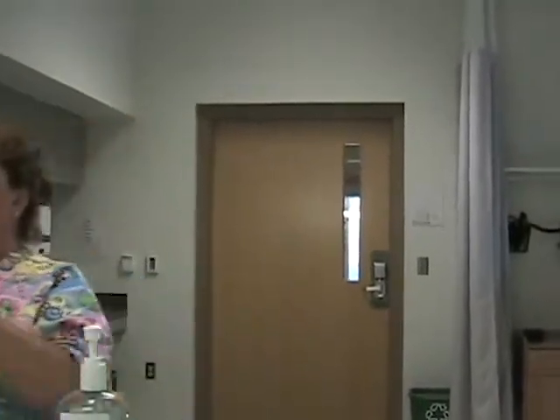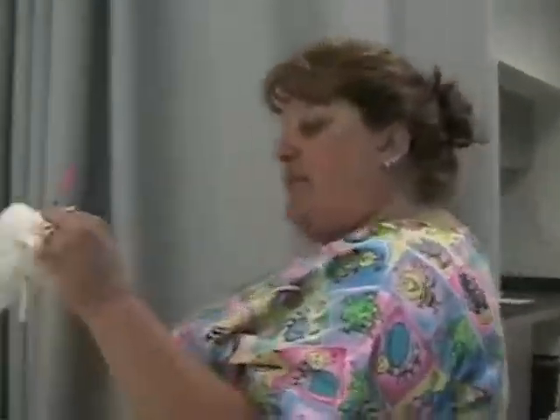Then you have that ready. You go ahead and grab your equipment. You will go ahead and grab your 2x2 gauze, your alcohol, your syringe, clean gloves. Go ahead and enter your patient's room, providing privacy. Come to your patient, identify your patient.